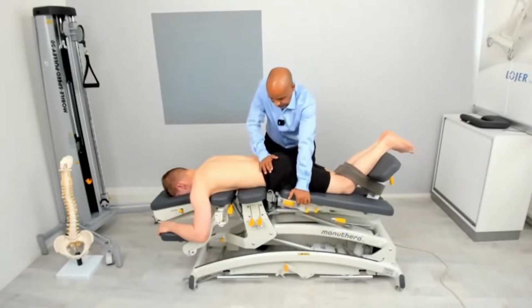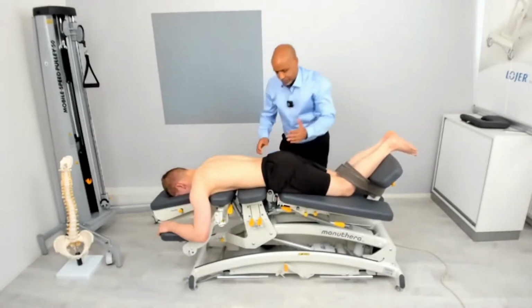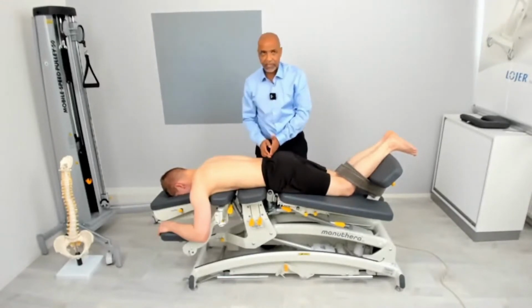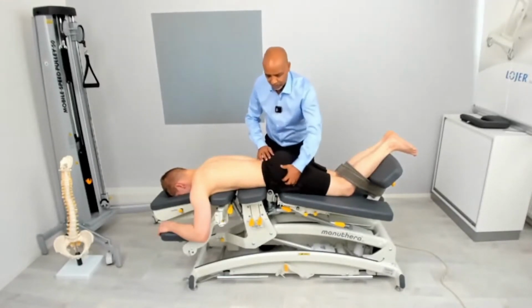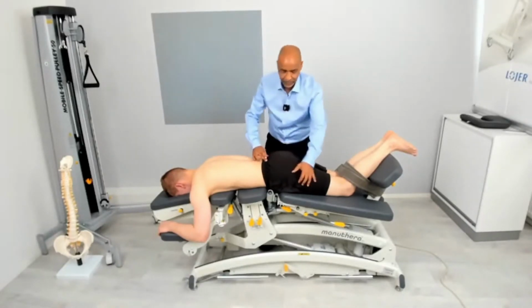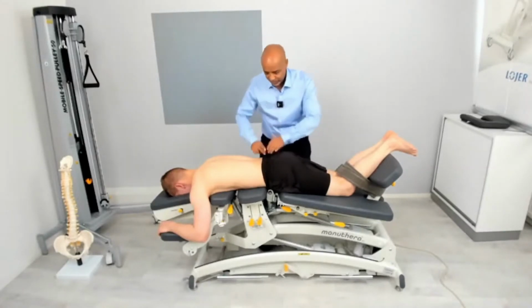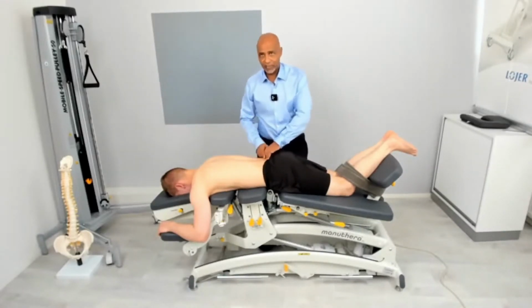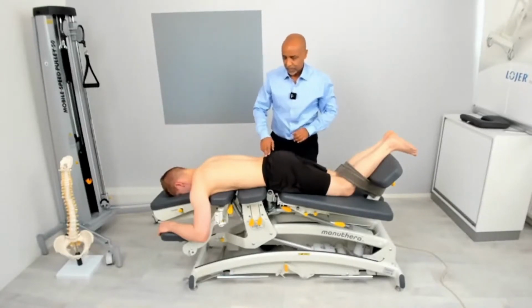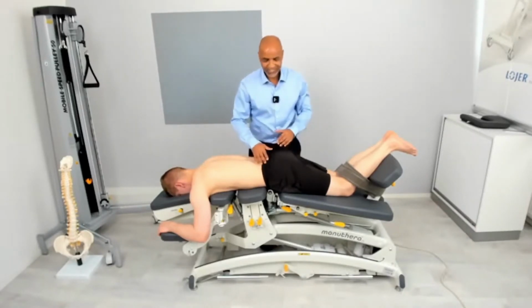This combination works extremely well, so you can be sure that you do both sides, because remember this is the end of the spine and you're dealing with the upper bones, the bigger bones, which is ilium, you have the sacrum and you have the femur bone. All these are big muscles and also the bigger bone when they meet the smaller one on L5 and S1. So you need to create that particular angle. So once we establish that, and then we're thinking about what next.